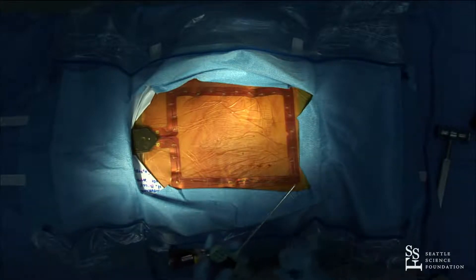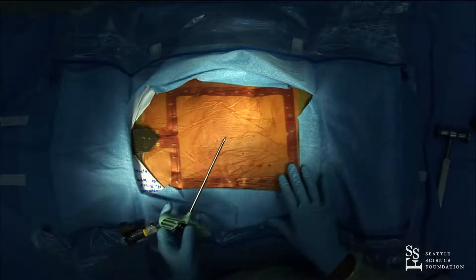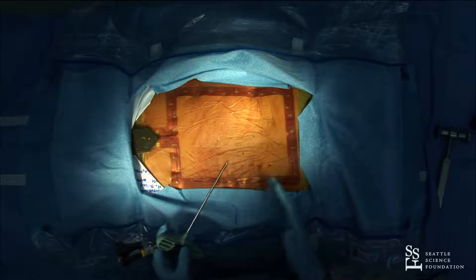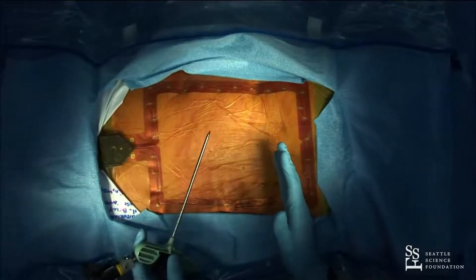For a decompression, we're not experiencing a lot of skin shift, so I put the mask essentially around the area where I'm working. If I'm doing an L3-4, L4-5, L5-S1 decompression at any of those levels, that's where I'll put the mask.